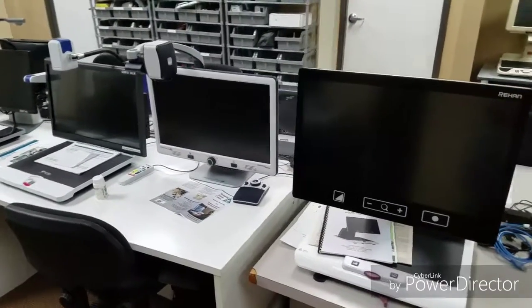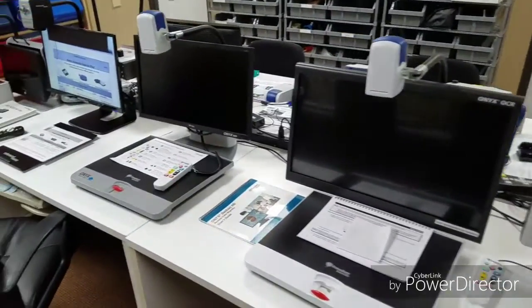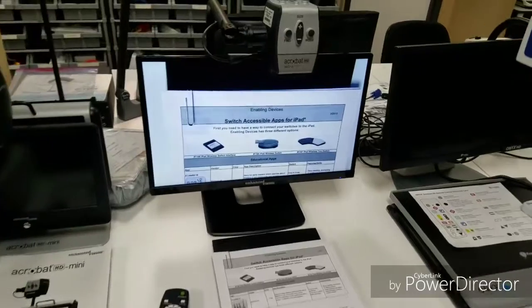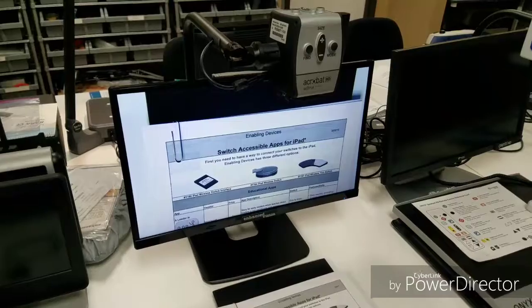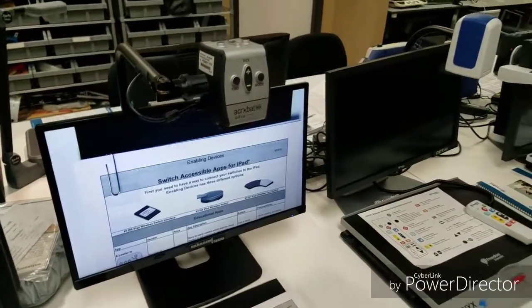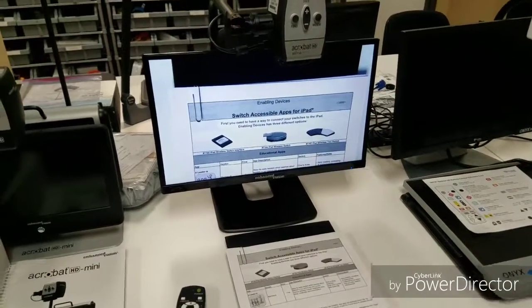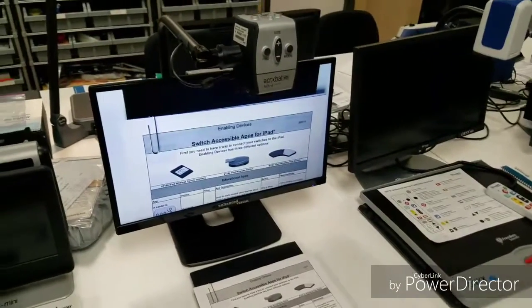If you work in the school systems, you'll pretty regularly see these for a lot of the students with low vision in their classroom. What these do is in essence the same thing that a lot of the handheld magnifiers do. However, the magnification quality is usually a lot better. You can get a larger screen. So for someone who can't see on a very small one, the larger screens enable them to see a little bit more. I always say that magnification and screen size has a correlation similar to if I could physically take and stretch a picture. Regardless of the size of the picture, if I could just take it and make it larger, that's in essence what we're doing with the screen. So magnification on a 7-inch screen compared to a 22-inch is much larger on a 22-inch.